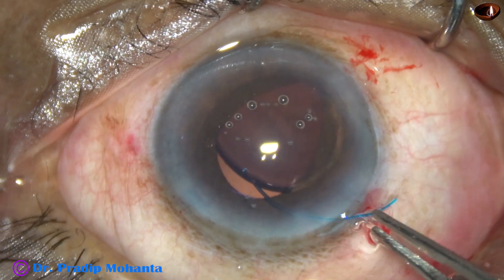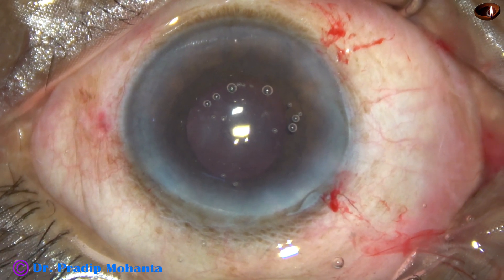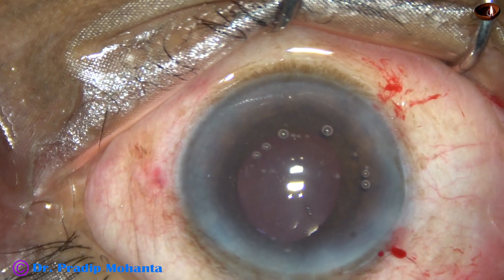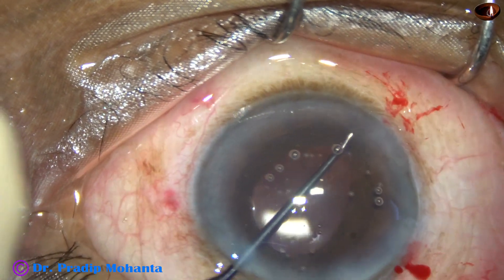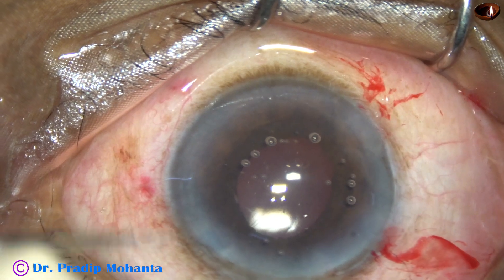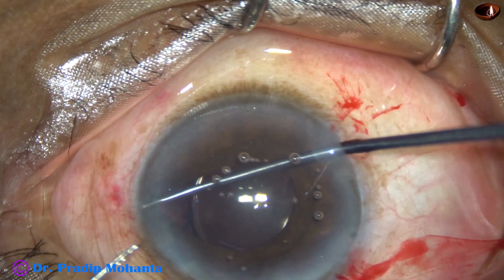A McPherson's forceps is used to place the trailing haptic in the capsular bag. In this case the pupil is small, so to confirm that the haptics are in the capsular bag and not in the sulcus, an iris retractor is used. We can examine the rhexis margin just at the haptic-optic junction, and in this way we know that the haptics are in the capsular bag.